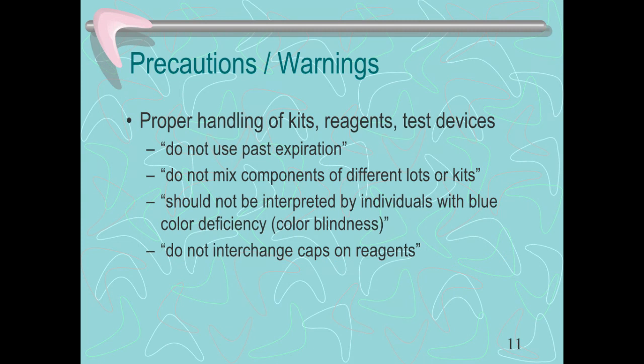Precautions and warnings. Kits, reagents, and testing devices, how to handle them. Don't use past the expiration date. That's a really good thing for testing strips, or any kind of testing product. Once something has reached the expiration date on anything in the facility, you're going to need to get rid of that. Don't mix components of different lots and kits.